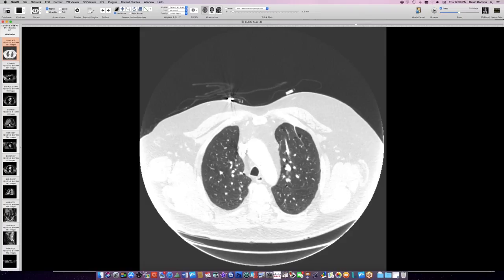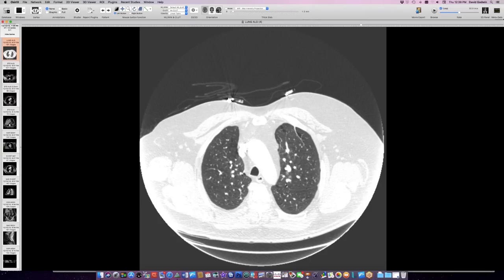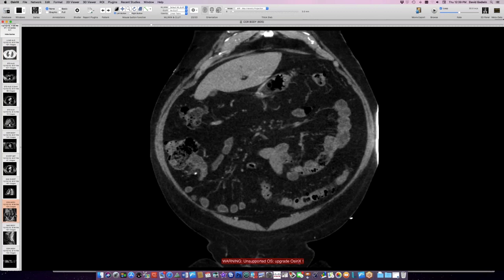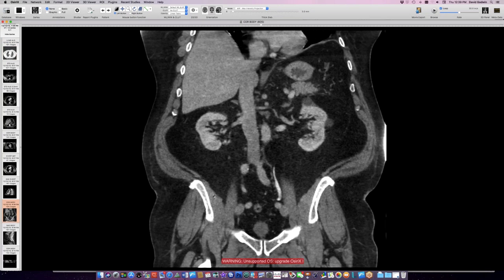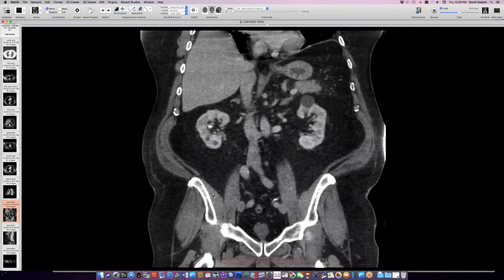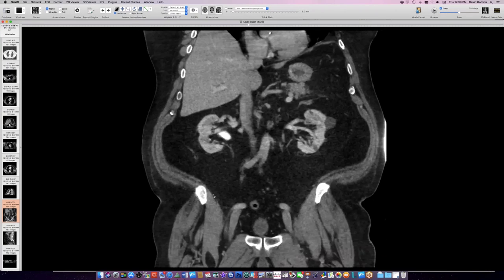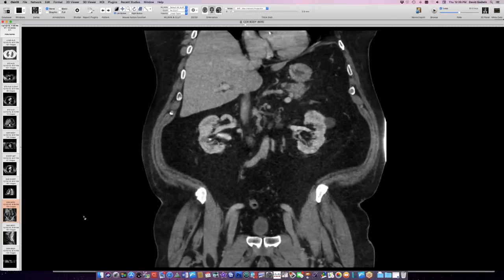He has cystic lung disease concentrated at the bases — not as many lesions as the young woman. Some cysts are elliptical, some along edges of lobes, some along veins. This is Birt-Hogg-Dubé syndrome. He presented with bilateral pneumothorax, got pleurodesis, and has a family history positive for malignancies and pneumothorax.